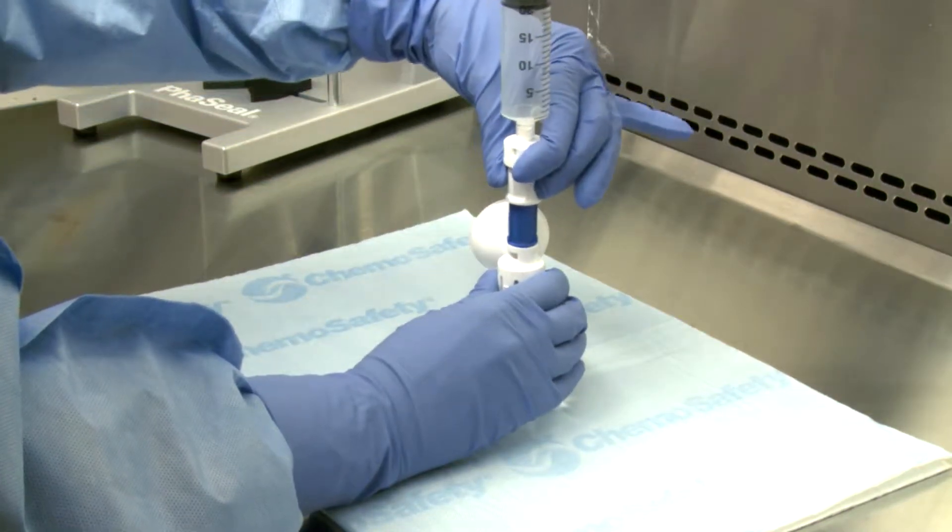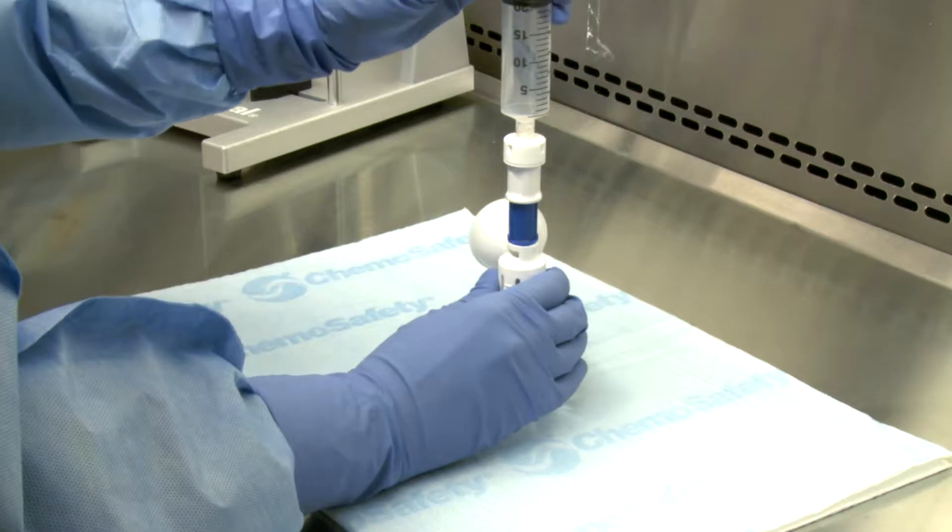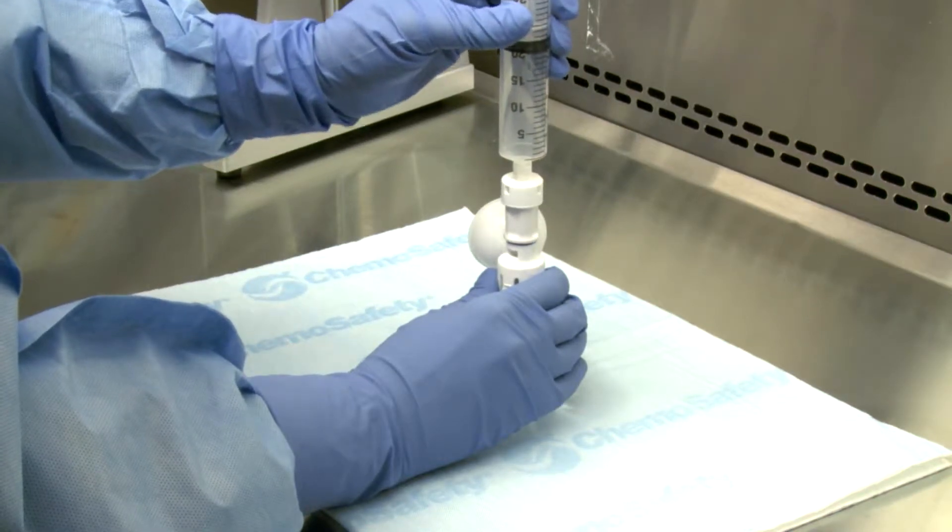Hold the white finger grip and turn clockwise. Finally, push down to engage.